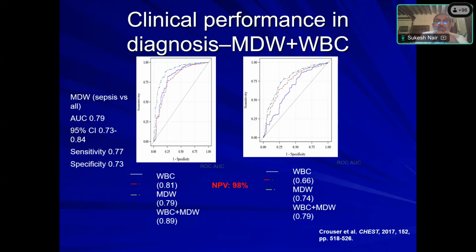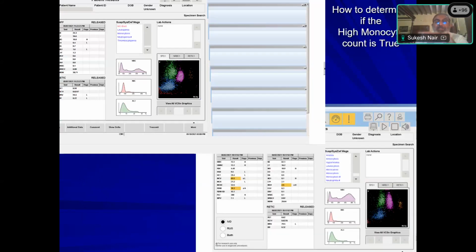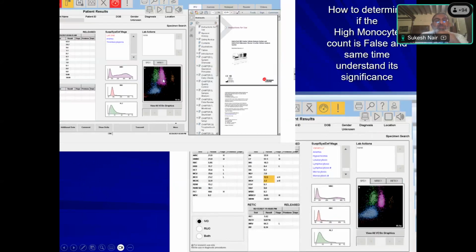But interestingly, we found that in a patient who has sepsis, the neutrophils become large. They have the same granules. So in the large neutrophil, the same granules will scatter less, and they will become monocytes. So here you can see that the neutrophils are large, have the same granules, and because they are large and they have the same granules, they'll scatter less light.